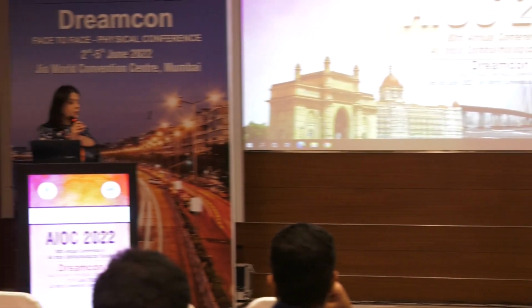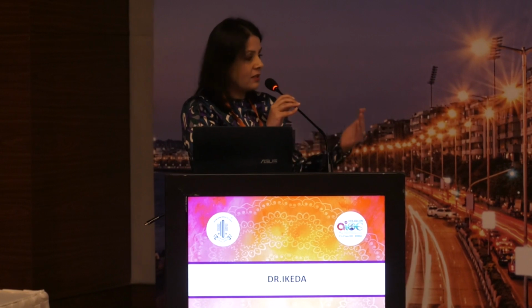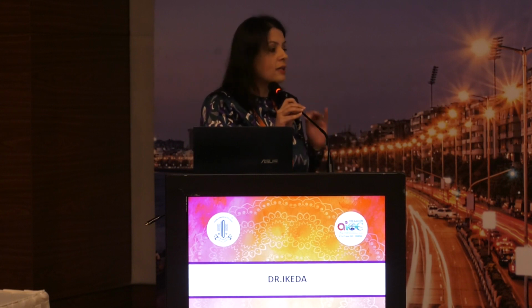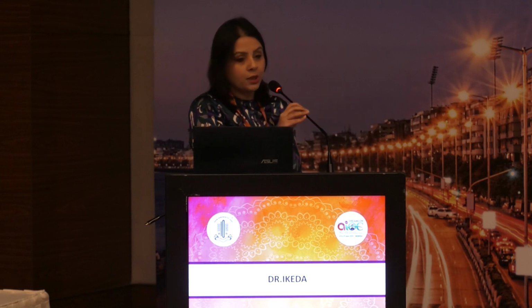Second is, why did you do a trabeculectomy? Were medicines not effective enough? Yes, so first thing is YAG PI. If it was my patient, first of all, I would recognize it on table if I flipped the ICL and remove it. And secondly, if this, God forbid, happens to me, I would not do YAG PIs for her. I don't think that's the way to go. You need to explant this ICL as early as possible. That is the way to go. That's what the operating surgeon had done. She had just come to me for a second opinion.